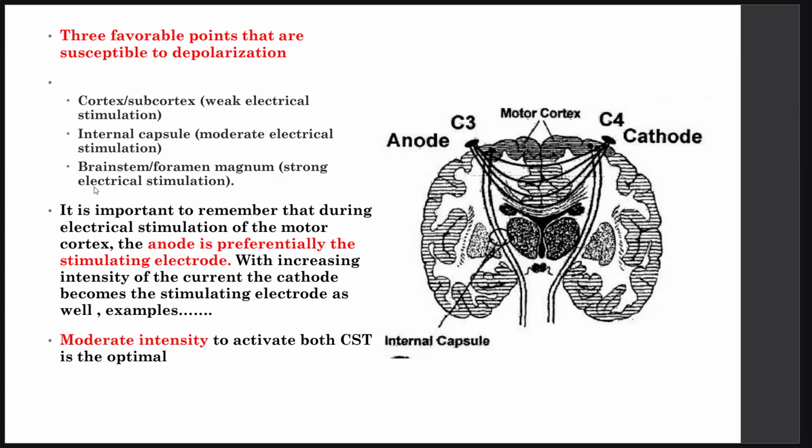Not necessarily only the pyramidal cells of layer 5 can be stimulated. Stimulation reaching the cortex, stimulating layer 5 of the cortical neurons, can give me a motor evoked potential. Stimulation reaching the corticospinal tract in the corona radiata, somewhat deeper, can stimulate the corticospinal tract, and the volley of stimulation can go on down to the motor system, so I can get a response from them. And if I give a very high current, I might even stimulate the corticospinal tract at the brainstem, at the medulla.